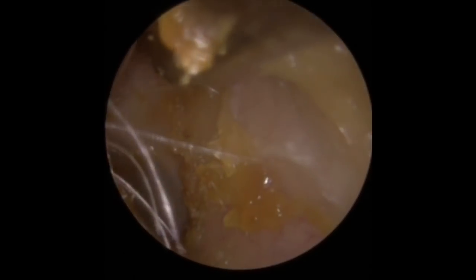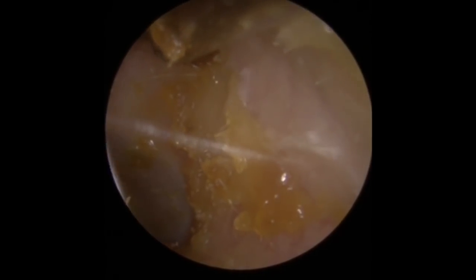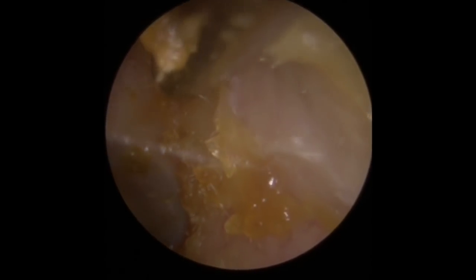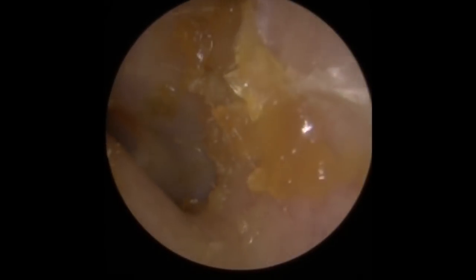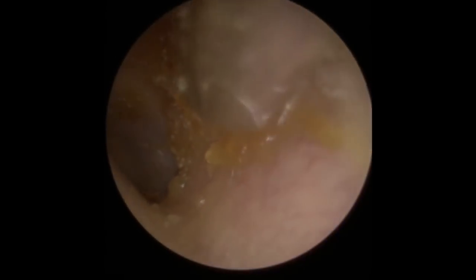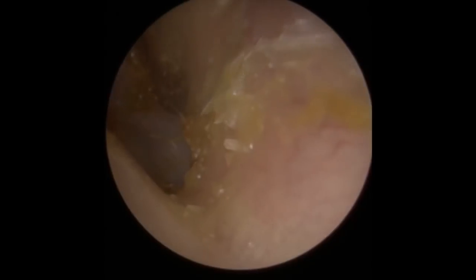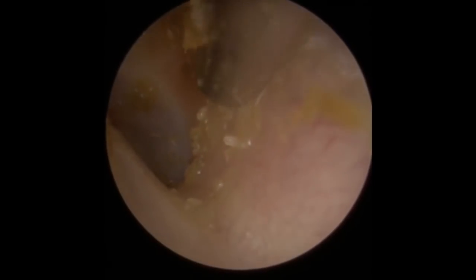Got a little bit of wax here at the top of the canal so I'm just going to try and get that away. Not so worried about the lighter coloured material to the right hand side — that's more newly formed wax. Just taking bits of that away, a bit of dry skin there. And there was the eardrum.